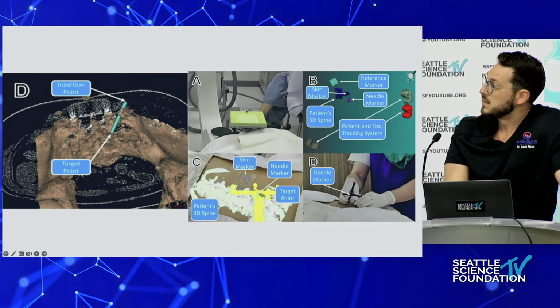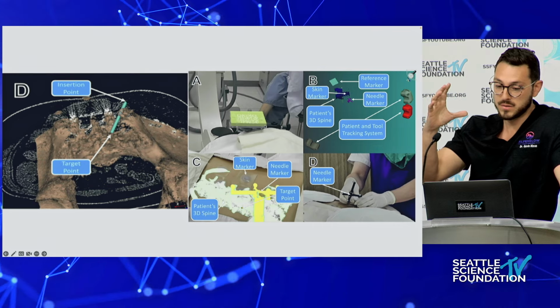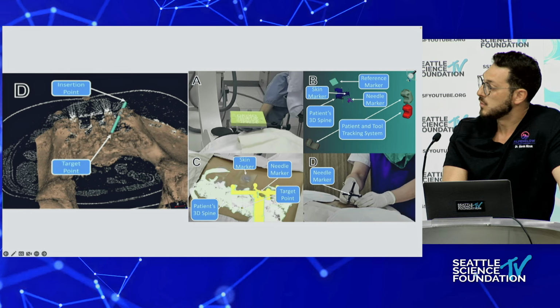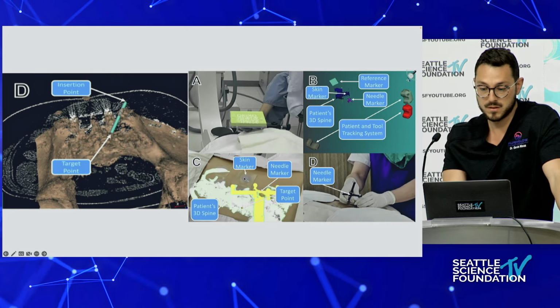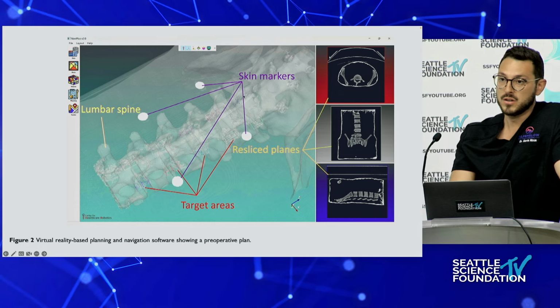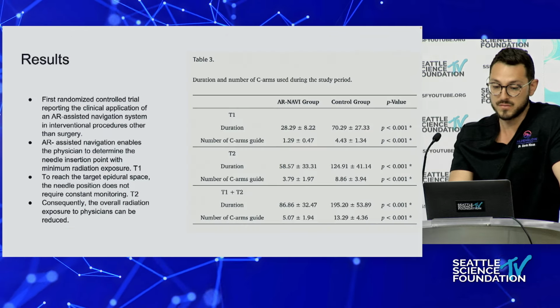This picture is not my favorite, but it just goes to show that once the patient's on the table, there has to be a large QR code that is able to reference track with your headset that's always looking at this code. And every tool that you're using has some sort of tracking device that helps you know where you are in space, as well as where the skin markers are, so everything's superimposed onto the patient. This is a picture from one of the previous studies they had done on a phantom cadaver when they were doing the proof of concept that you could actually drive a needle under augmented reality and achieve correct needle placement with much less need for consistent fluoroscopy.